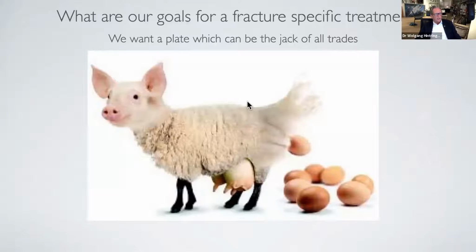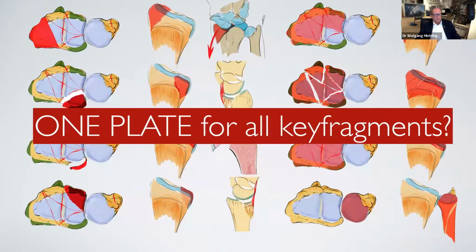So now, what are our goals for a fracture-specific treatment? We want a plate which can be the jack of all trades. But the question is, is one plate for all key fragments possible? Can you stabilize all these fractures with only one plate?